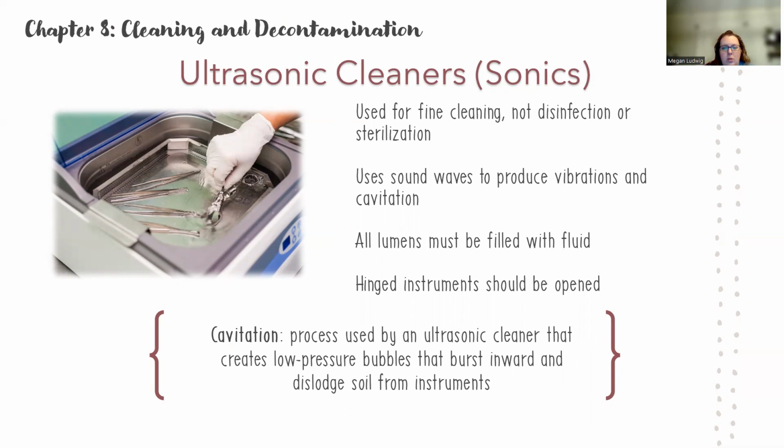So cavitation, this term down here you need to know, is the process used by an ultrasonic cleaner that creates enough bubbles because of the waves that burst inward and help dislodge the soil from the instruments. So it's like shaking it off with the sound waves, all the debris comes with it, which is kind of cool. If you're using any lumens, like maybe a suction, you want to make sure fluid gets in that lumen. That way the bubbles get inside the lumen as well. Otherwise it's ineffective. And again, hinged instruments should always be open to reach every crevice of every instrument.